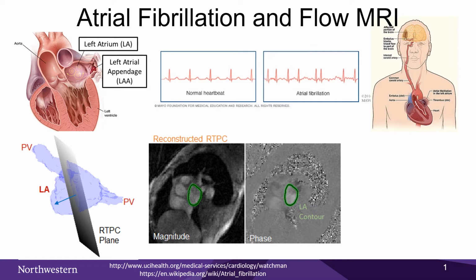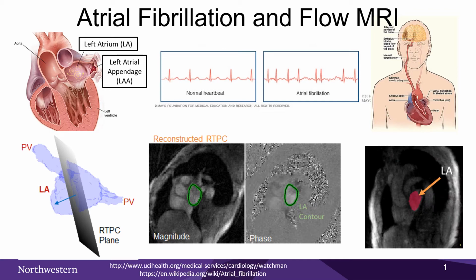However, this technique requires segmentation of the 2D left atrium, which is clinically infeasible for hundreds of frames per patient. So the purpose of this proposed project was to train an AI to perform the segmentation of the left atrium from 2D real-time phase contrast images automatically.